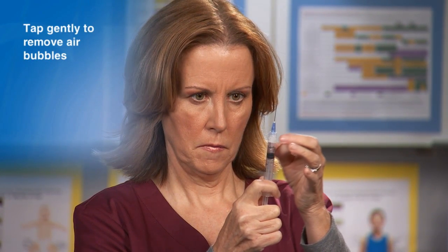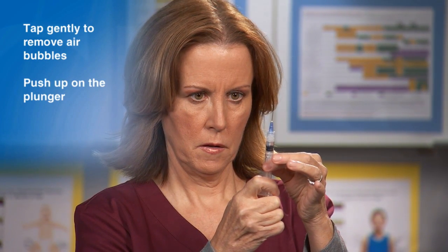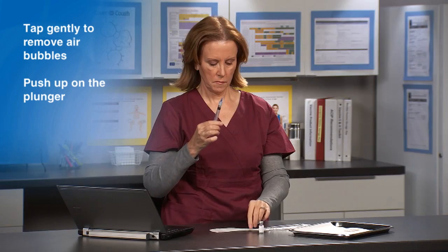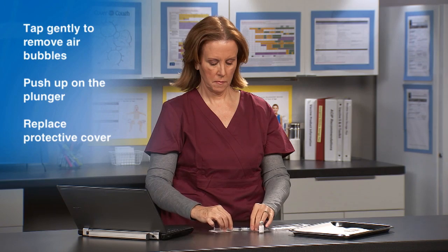To release any air bubbles, tap gently on the barrel of the syringe and then push up on the plunger, being careful not to expel the vaccine. Now, recap the needle by replacing the protective cover on the needle.